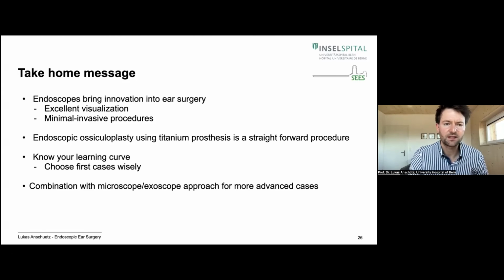So the take-home message from my side would be that the endoscope brings innovation into ear surgery. It provides you excellent visualization, and you are able to provide minimally invasive procedures to the patients. The patients will be forever grateful because they have no scars and they are fit again in a very short time. Then the endoscopic ossiculoplasty with the titanium prosthesis is quite straightforward, as you just saw.